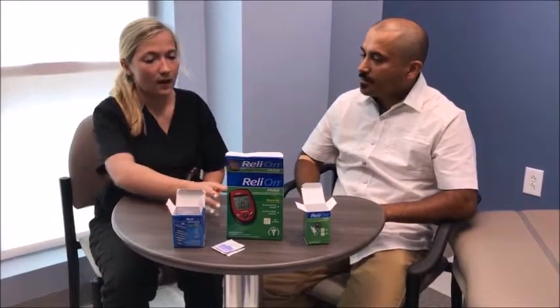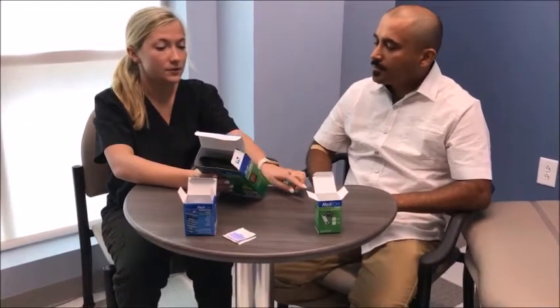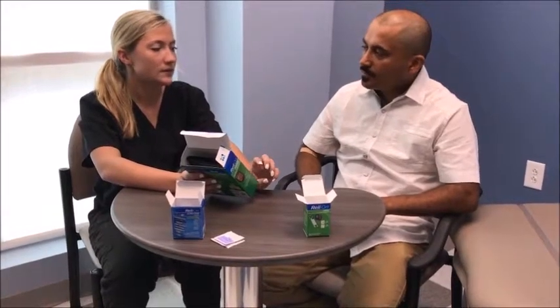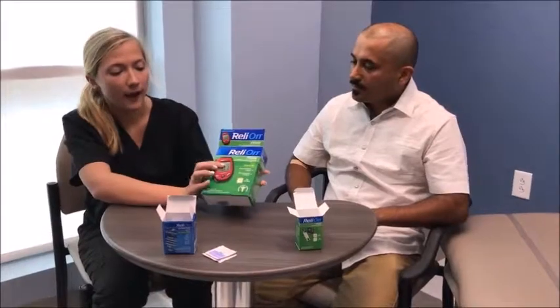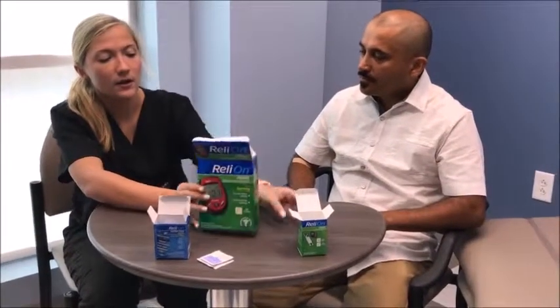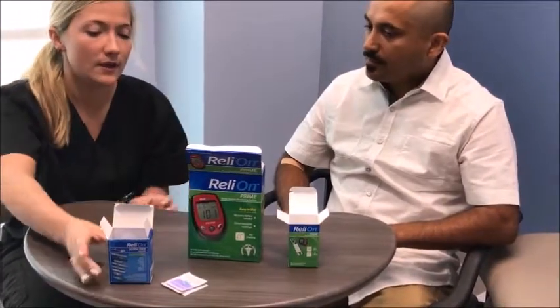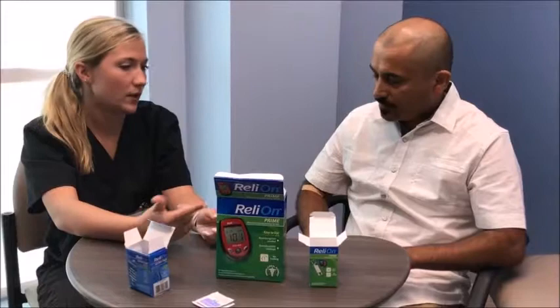Today we're going to talk about using a glucometer to check your blood sugar. A glucometer is a machine where you can draw your blood and put it onto a strip that the glucometer reads, and then the glucometer will sense how much sugar is in your blood. You have to buy strips separately, as well as lancets to prick your finger to get the blood for the strip.